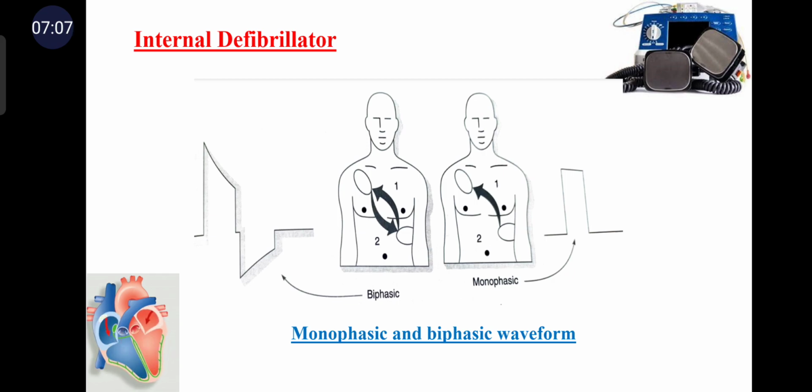The discharge current pulse duration is in the range of 2.5 to 3.5 milliseconds for most defibrillators and doesn't increase very much with the patient impedance. So it is based on several research studies. A biphasic truncated exponential waveform has become the standard waveform.